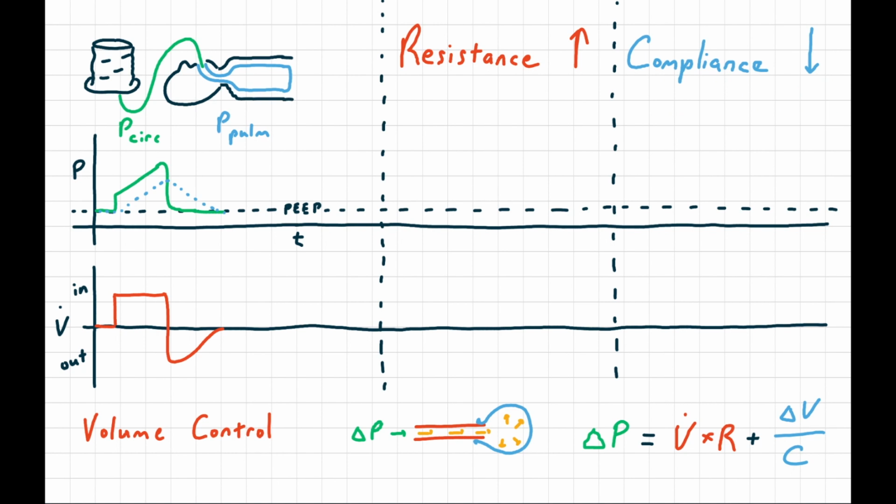And there's a trick you can perform on any modern ventilator to tease out the difference, and that's called an inspiratory pause or inspiratory hold. So if we look to the left at our standard volume control breath, the ventilator delivers a set volume flow rate for a certain period of time. Your circuit pressure increases to force that flow rate into the lungs.